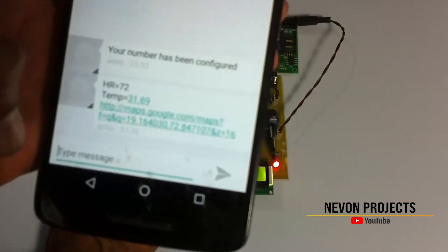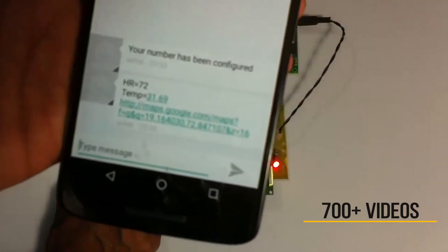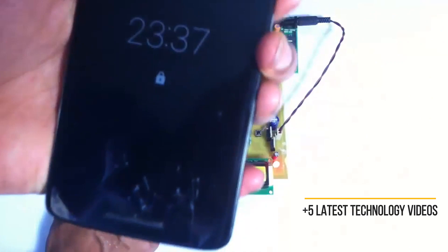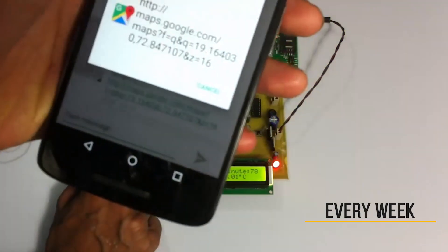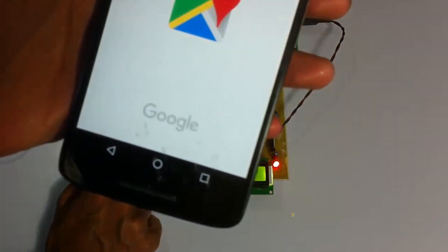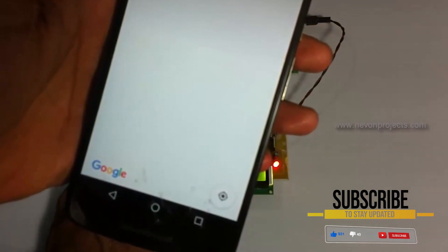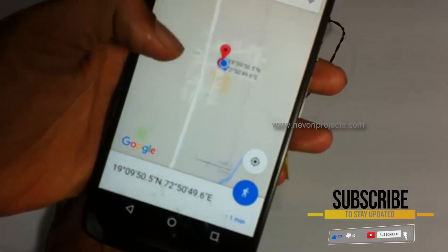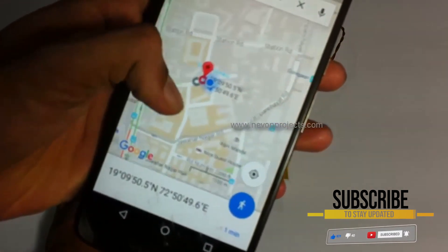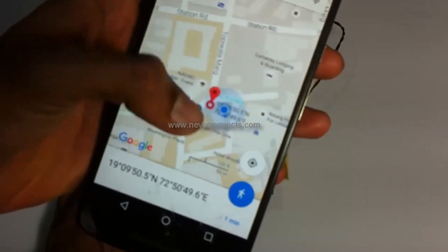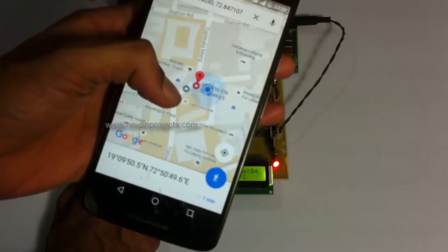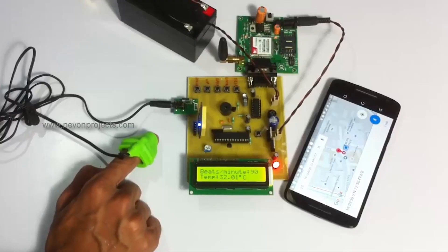As you can see, we have received the first message displaying the soldier's health status as well as a link — the GPS coordinate link. When we click on that link, we can check the GPS position of the soldier on a map. It keeps transmitting this data every minute so that we can get real-time health as well as position status of the soldier.